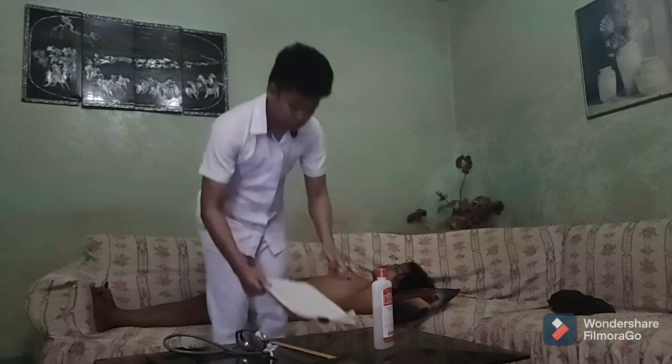So, auscultate with the patient assuming another position. This is to identify normal and abnormal sounds and to note rate, rhythm, extra sounds, or murmurs. Ask the client to assume a left lateral position, use the bell of the stethoscope, and listen at the apex of the heart. The bell is best for detecting low pitch sounds.